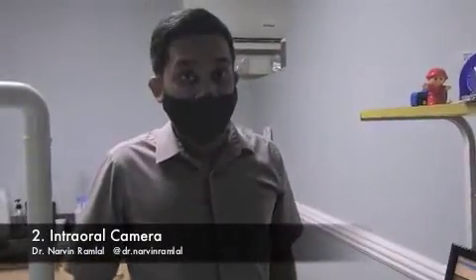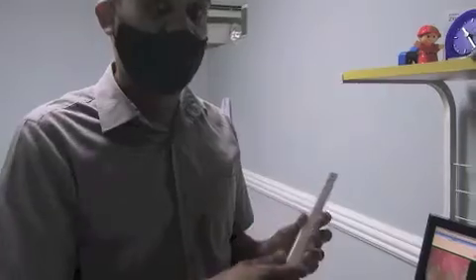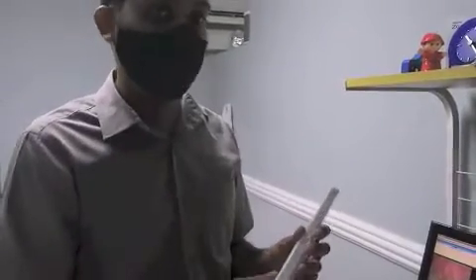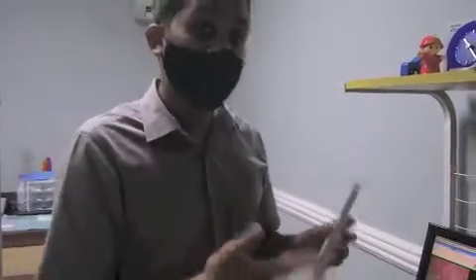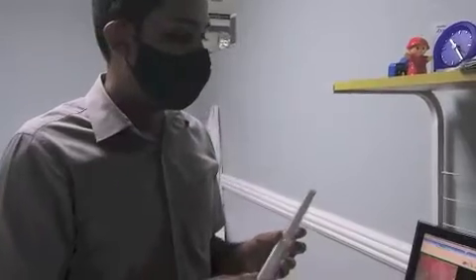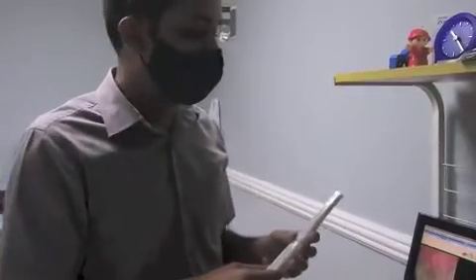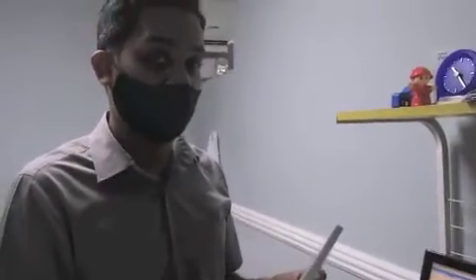Hi, so I'm Dr. Ramlal. I'm here today just to talk briefly about intraoral cameras, right? So essentially an intraoral camera is a small digital camera that goes inside the mouth, and we're able to show patients what we're seeing. It's a great tool to communicate with patients, to demonstrate to them what's going on in the mouth. It really makes a difference, and it really helps with patient acceptance of treatment and communicating.